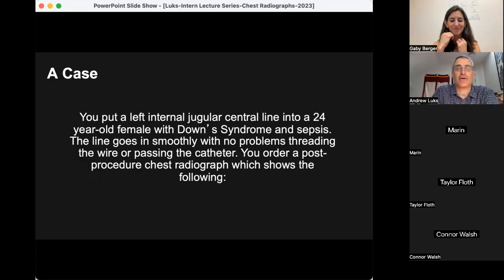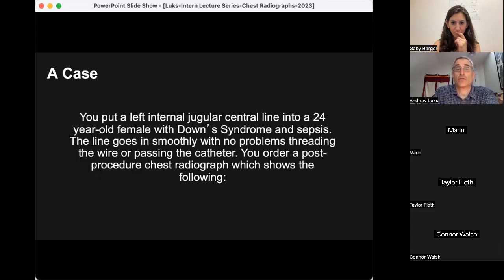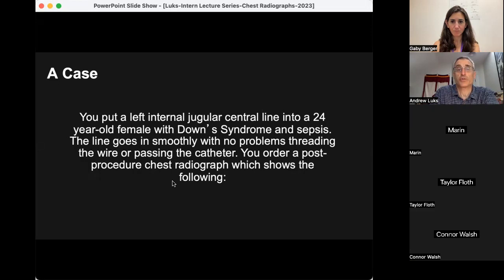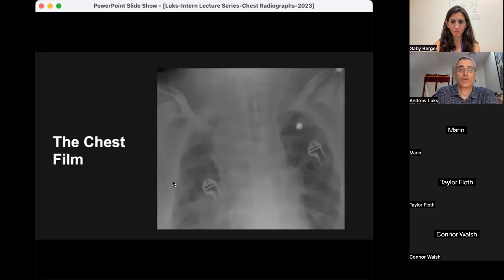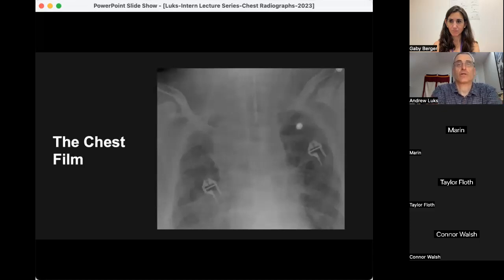Let's get started with a case. You had the opportunity to do a central venous catheter placement during your intern year and you put a left internal jugular central venous catheter into a 24-year-old female with Down syndrome admitted with sepsis. The line goes in smoothly — no problems threading the wire or passing the catheter — and you appropriately order a post-procedure chest radiograph, which shows the following. Take a look at this film.